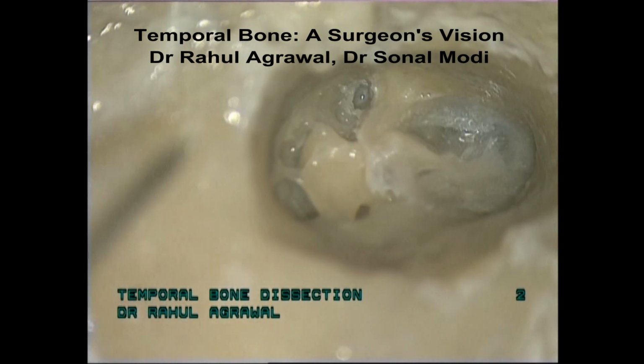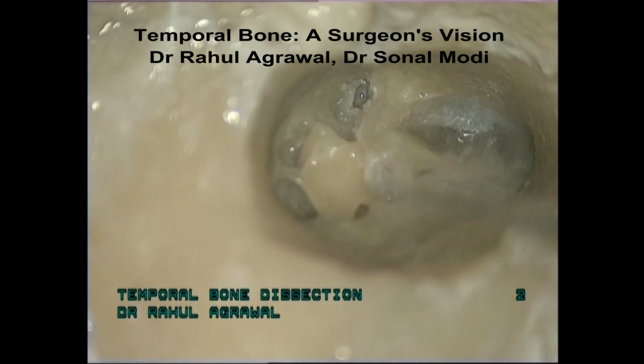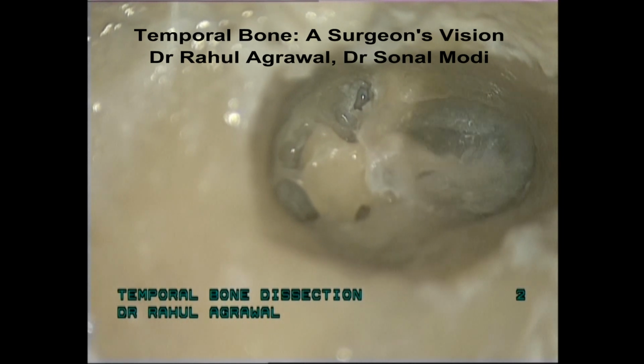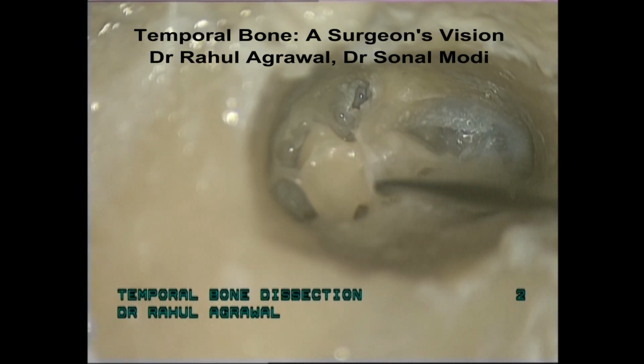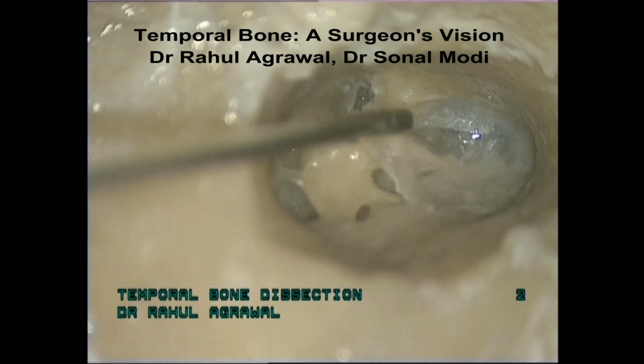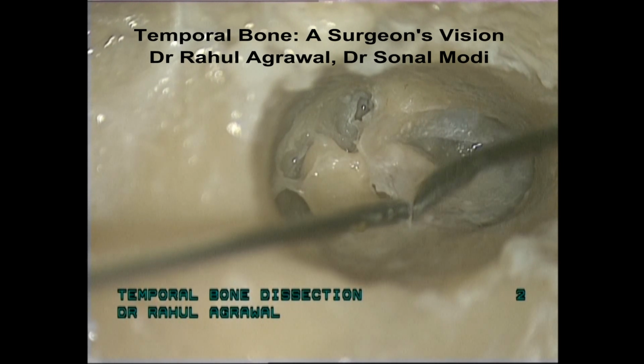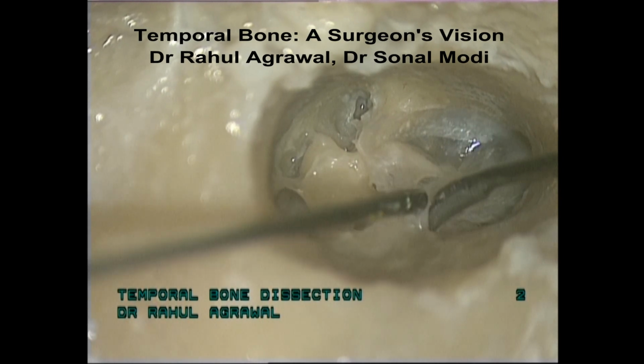That's the anterior attic completely exposed, and you can connect your anterior attic from there via supratubal cells to the eustachian tube. That's your anterior ventilation pathway. That's the anterior buttress. That's the posterior buttress. You can elevate part of the tympanic membrane to visualize the structures still better in that area.